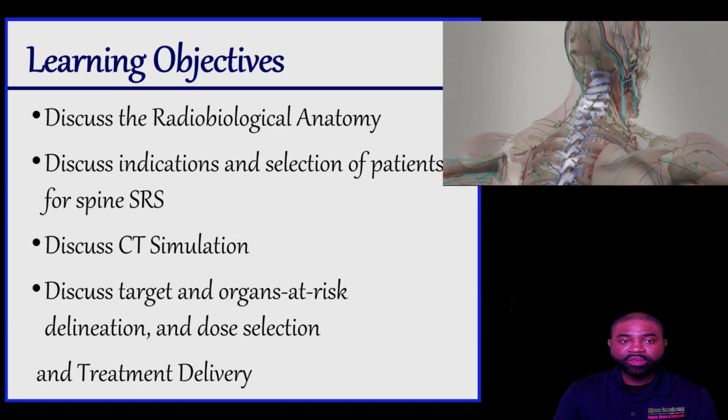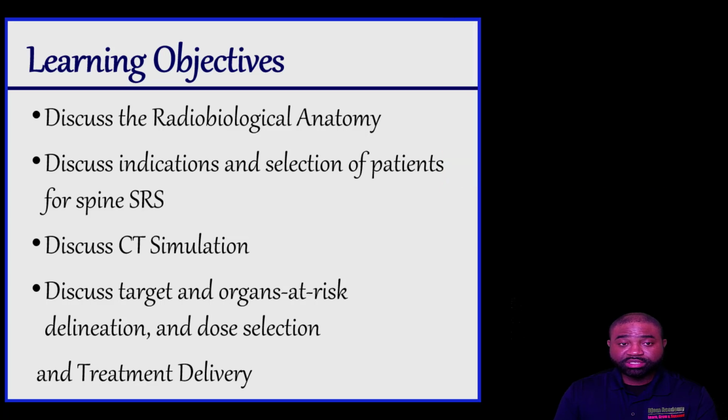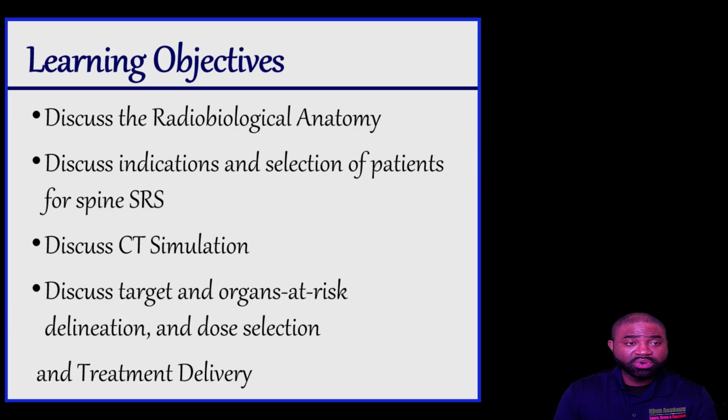Keep in mind that the most common presenting symptom for spine patients is back pain, and therefore back pain in turn limits how long as well as how a patient can be simulated or will be in or on the treatment table. And so we are going to look at the facets of how we could deal with this.